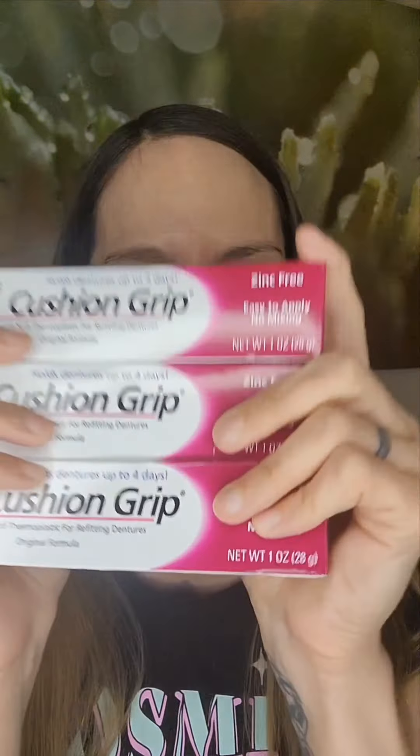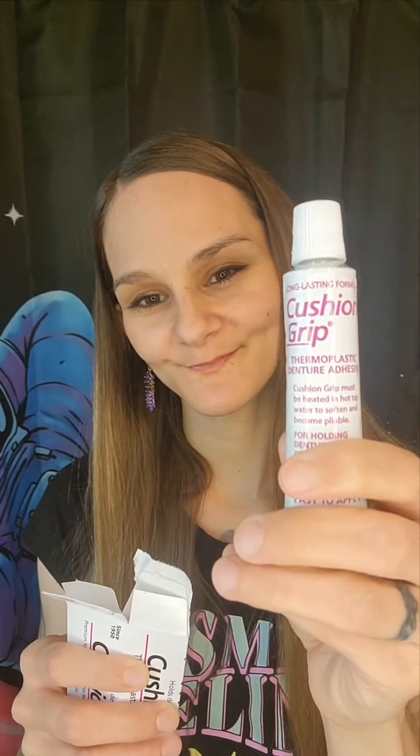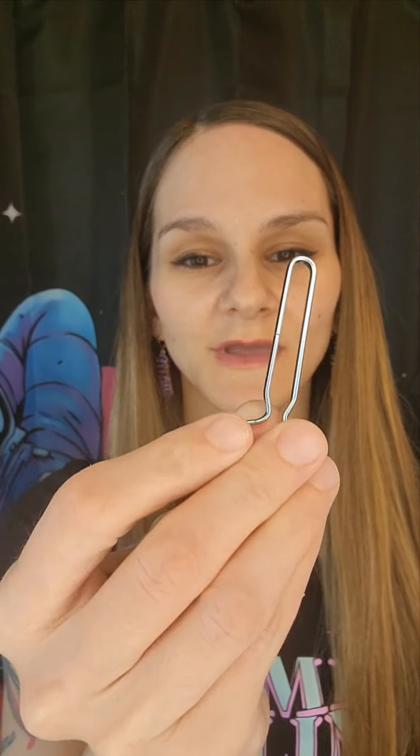I just got some new cushion grip in. Let's try it out. Let's open it up. So we have the instructions, which I don't need. We have our tube of cushion grip, and we have our key.